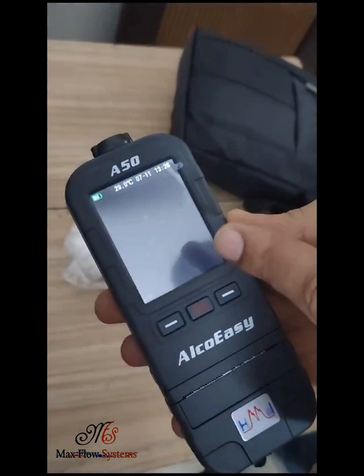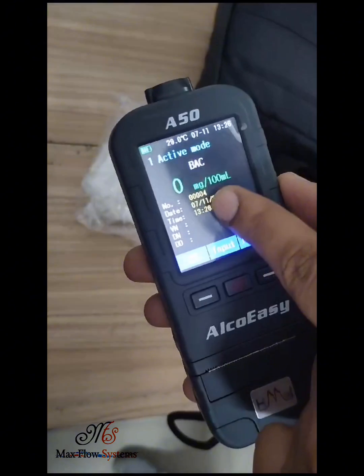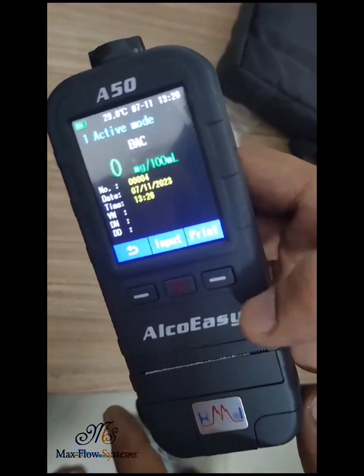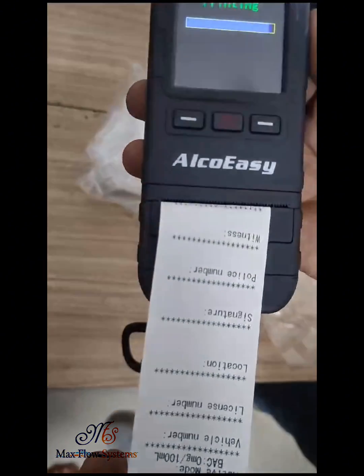Now you can see the result is being analyzed and the reading is showing 0 mg per 100 ml. If you want to print, you can just press this button and the reading will be shown on the paper.